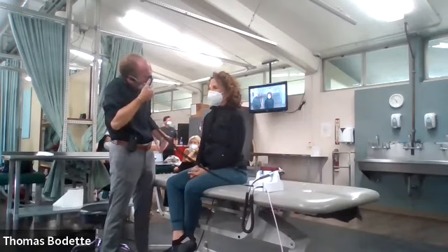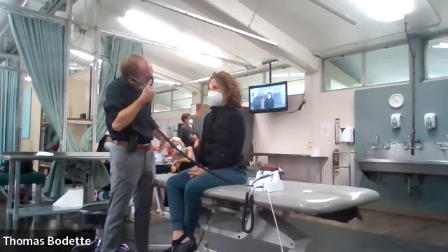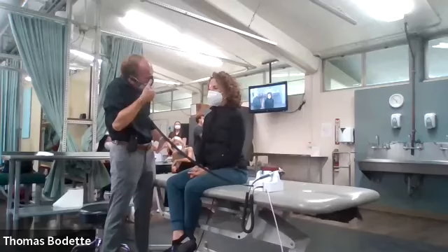Now, the very first thing that you should see when you shine the light source on her eye is sort of an orangish glow right there in the middle of the pupil. What you're actually seeing is a reflection of the light off the retina. And this is what's called the red light reflex. You're probably thinking, well, it's not red, it's almost orange. Well, I didn't make up the term. It's called the red reflex. So that's normal. You should see a red reflex.